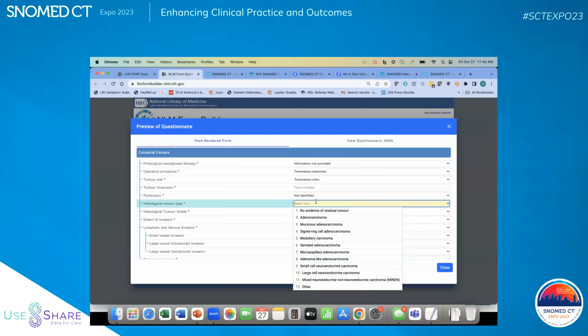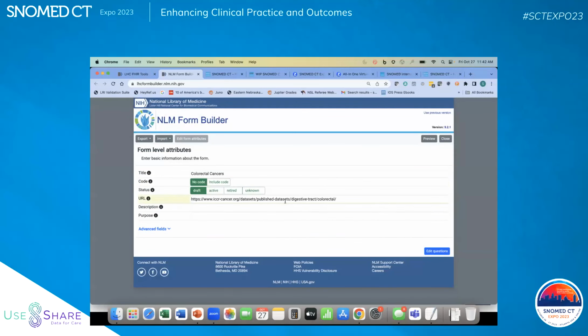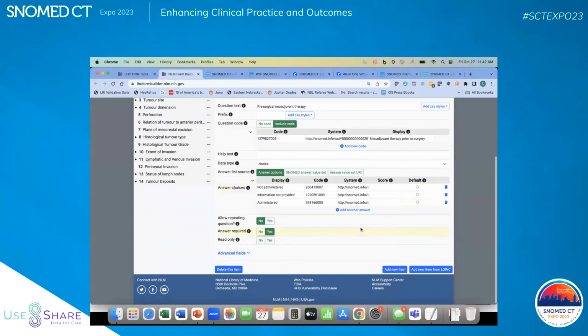Okay. So that being said, what this ends up looking like, which is kind of nice, is you do get a full set of SNOMED CT concepts, the URI for both question, answers, and the like. So this is one of the mechanisms we'll provide. There will be a link from the Confluence site, probably to a GitHub site, according to Alejandro. So we'll be able to link out to these value sets.